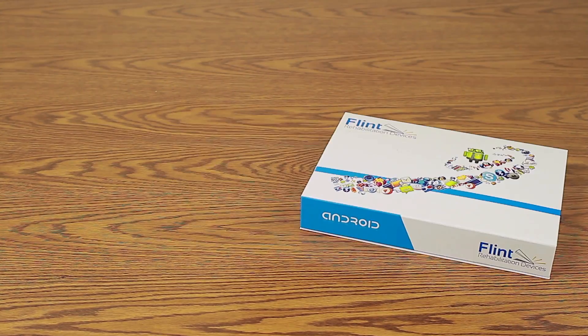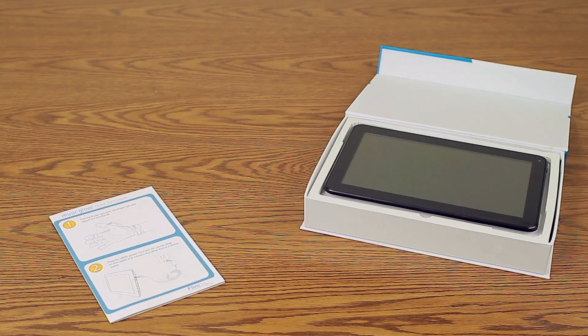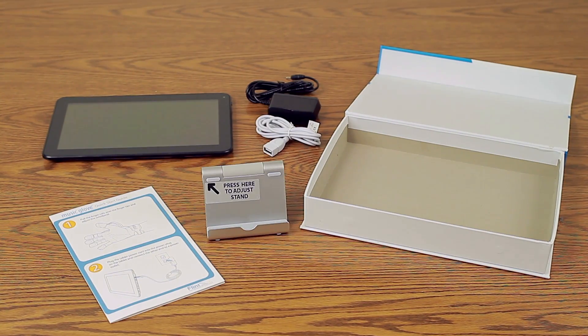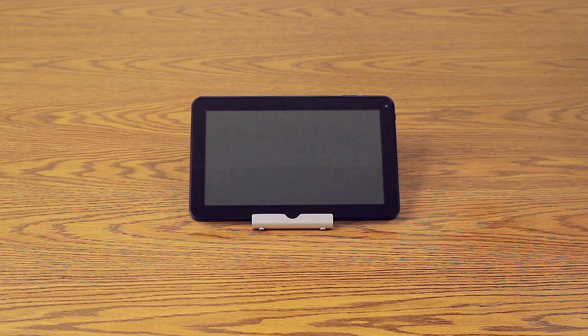Open the MusicGlove tablet box and remove the Quick Start Guide, tablet, power cord, MusicGlove connection cable, and tablet stand. Then place the tablet on the stand provided.